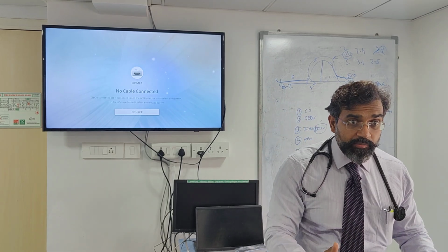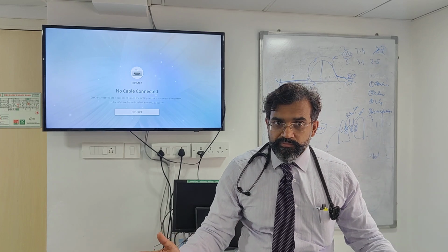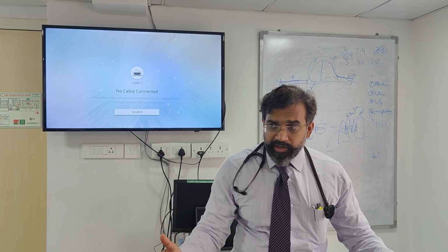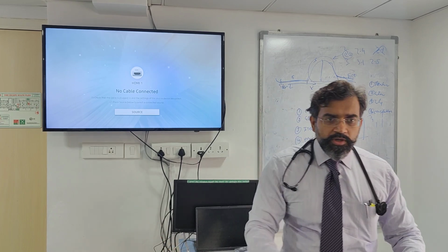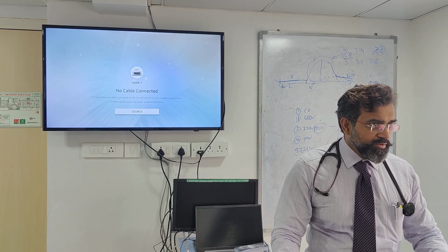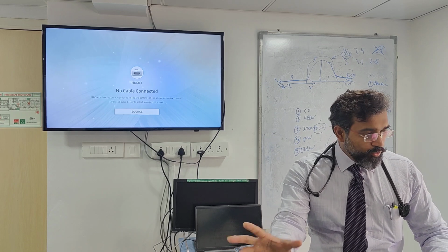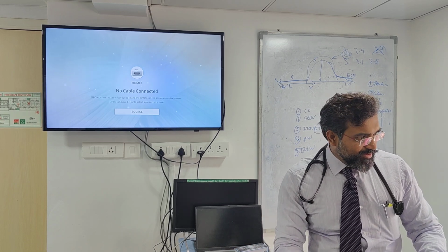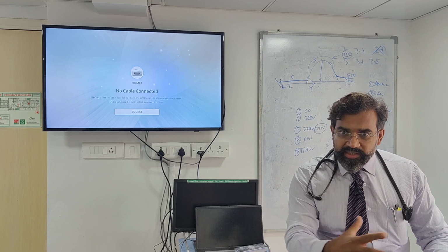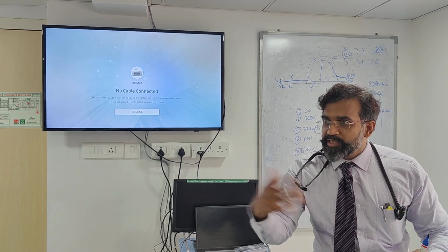You know what they did in Japan? A very interesting study. The patient was dying. Tagami, a person who does very beautiful studies. So the patient was dying, and just before death he did thermodilution and got the extravascular lung water. At the same time he did an ultrasound, calculated how much lung water, and put it into a lung score. And once that got over, the patient died.